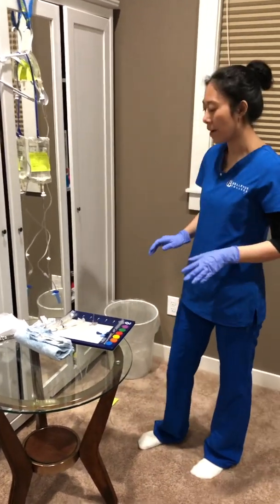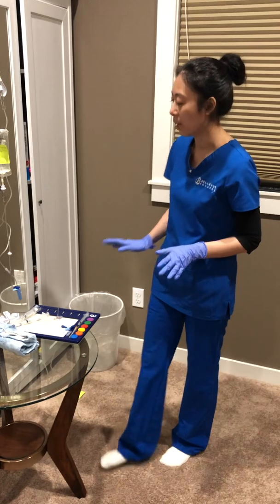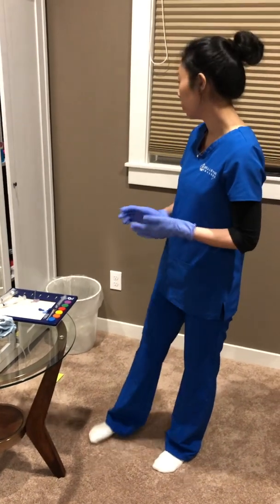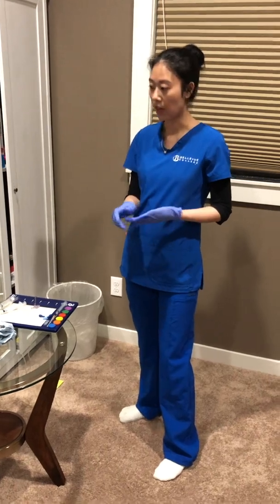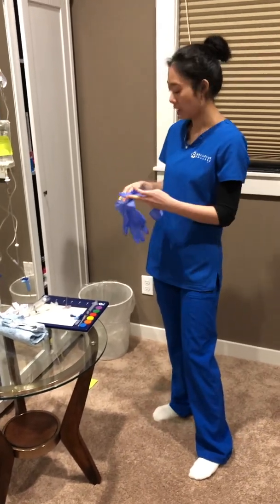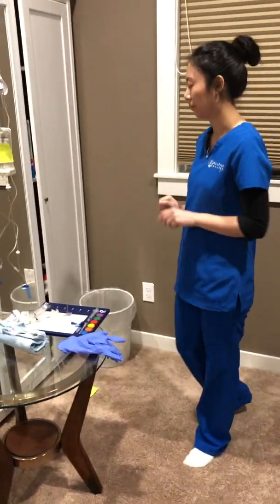Okay, now the IV medication is already done. If you have any questions, just let me know. I'm going ahead and lowering your bed. Here's the call light so you can reach it. I'm going to take my gloves off, do my hand hygiene, then I'm going to document it, okay? I will come back when your antibiotic is finished. Hand hygiene and document in the EHR tutor in the MAR. Thank you.